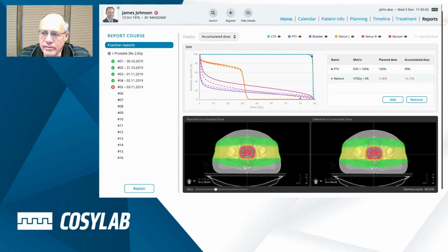The fact is that we now have a tool that will calculate these parameters in the background, and the physicist and the doctor, based on the flag, can go in and look. Of course, we'll look at this in depth, but I'm really excited about this tool happening in the background and utilizing data that would have either been lost or wasted.